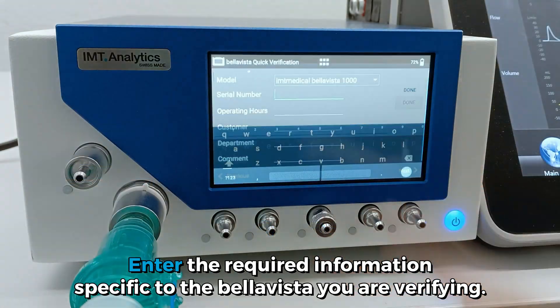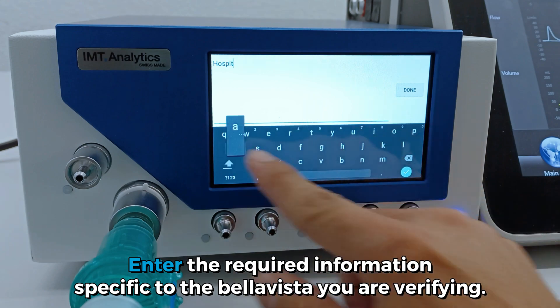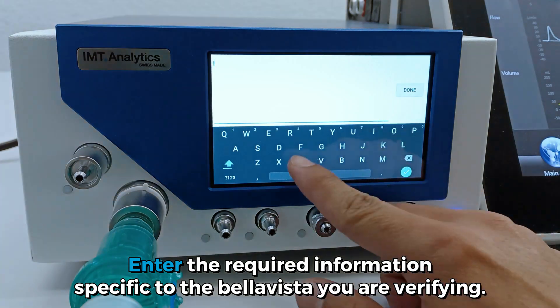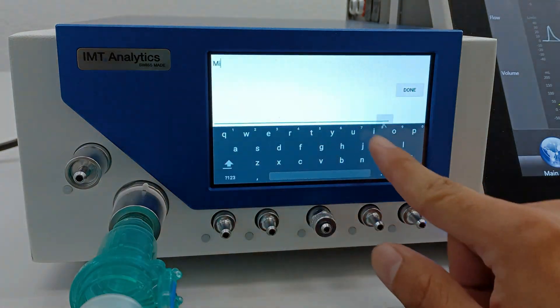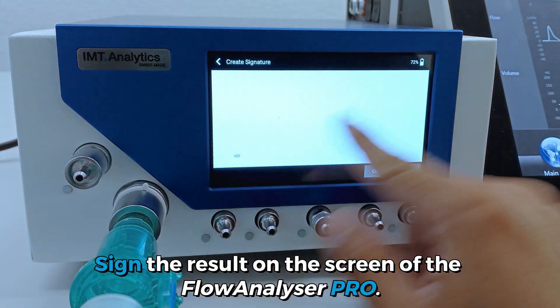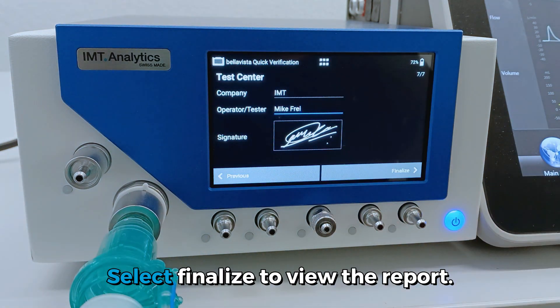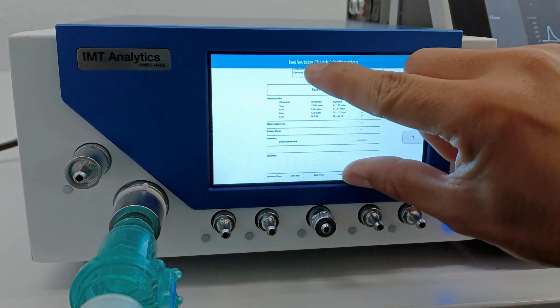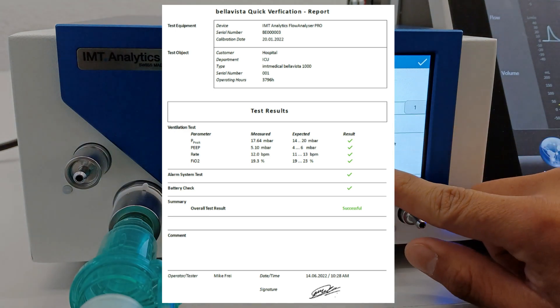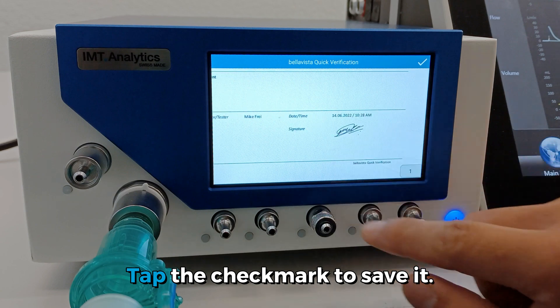Enter the required information specific to the BellaVista you're verifying. Select Done and Finalize to view the report. Then tap the check mark to save it.